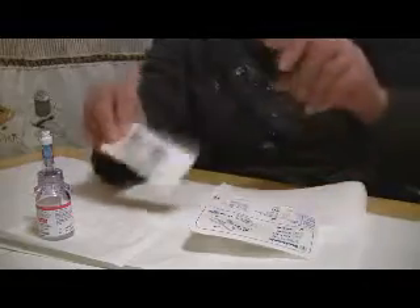First you take the bottle of your Remodulin and put it on your sterile drape. You take your Silhouette, which has your needle in there for when you're actually changing the site, and it also has your tubing. Tonight we're only going to be using the tubing portion, and you get your cassette as well.